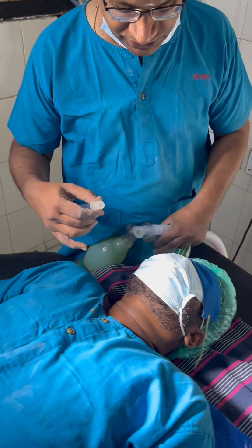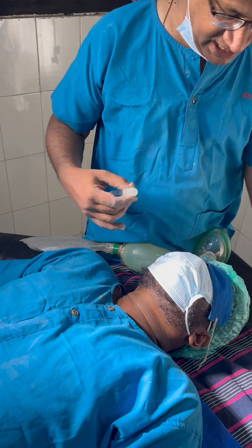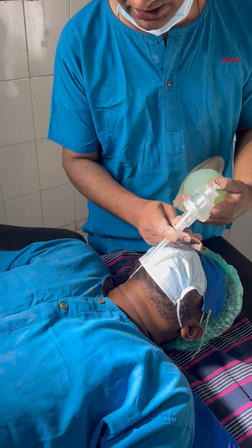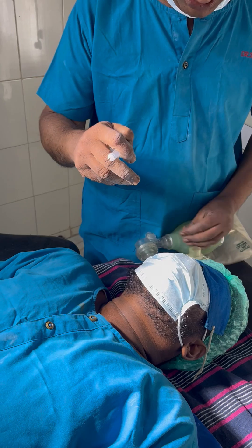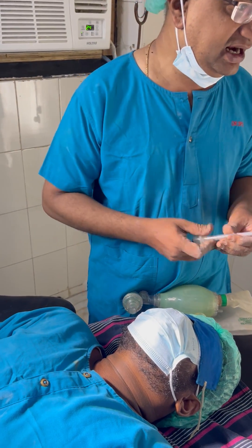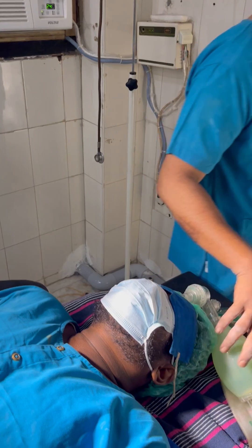You can give oxygen directly here, connect it, or you can also try to ventilate through an ambu bag like this. This is a needle cricothyrotomy, and the advantage is you can keep it like this and secure it with a plaster like this.